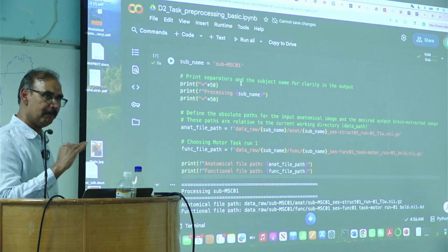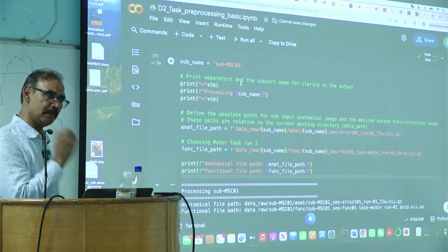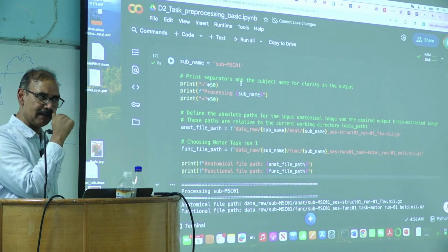All right. So basically, you just have to repeat the steps, but try to understand what is being done.